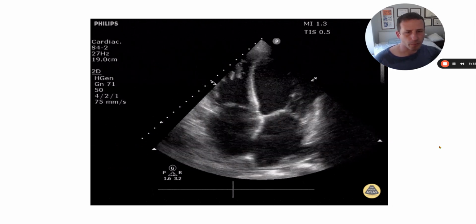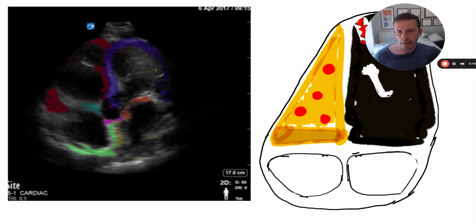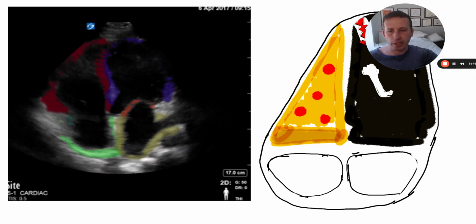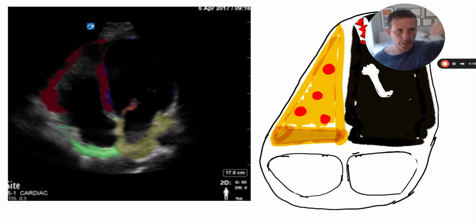So here's an example of a pretty severely reduced EF in an apical 4-chamber view. Notice the difference between this and if we look back here. You're getting good squeeze, right? Those walls are coming together pretty well. You're also seeing migration of those valves towards the apex with each squeeze. So that's that annular plane systolic excursion.